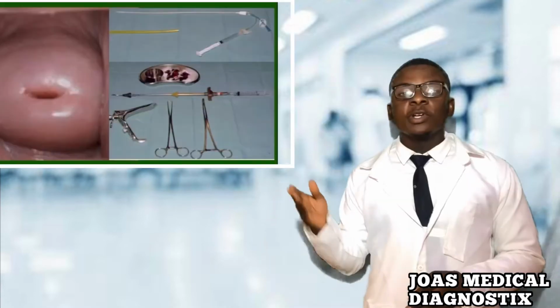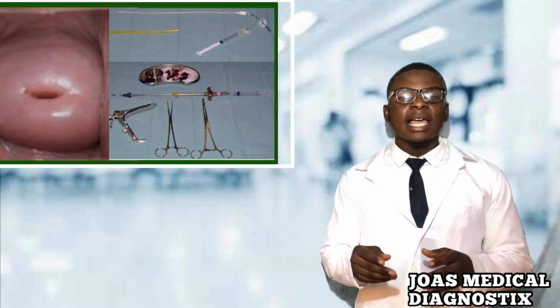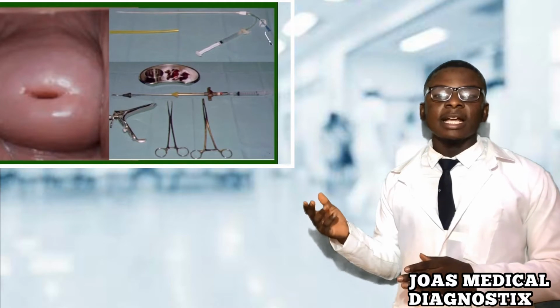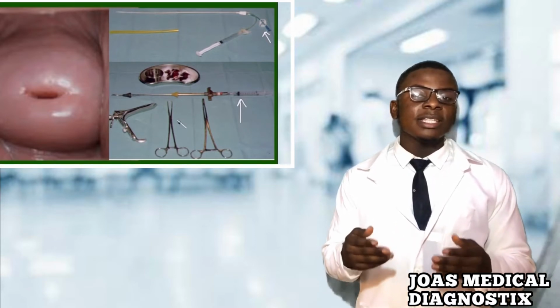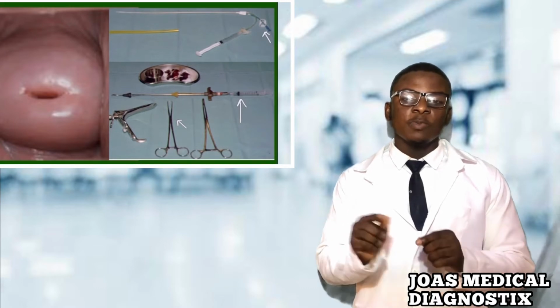and to confirm that the patient is not pregnant nor bleeding. After obtaining informed consent, the patient is placed into lithotomy position and a speculum is placed into the vagina. You can see a picture of the woman's cervix. The cervix will then be swabbed with Betadine and a catheter or cannula will gently be placed into the cervix or into the uterus. You can see a catheter and a cannula that will be used during the procedure. The other instrument included is a single tooth tenaculum, which can be used to grasp the cervix to help with positioning.